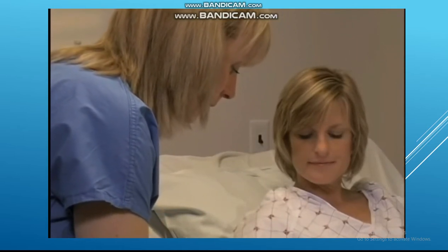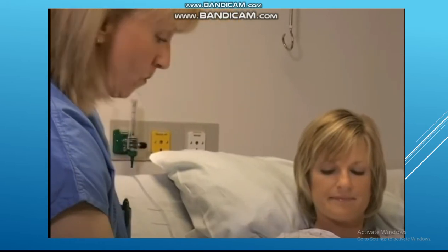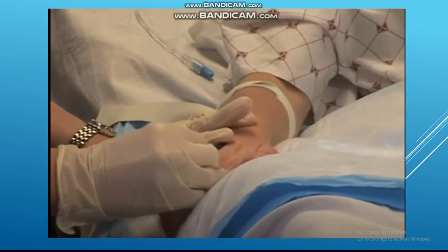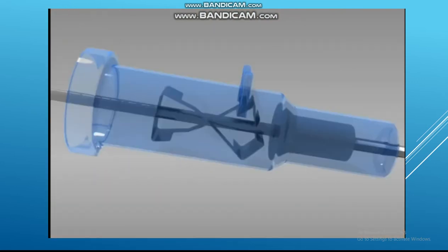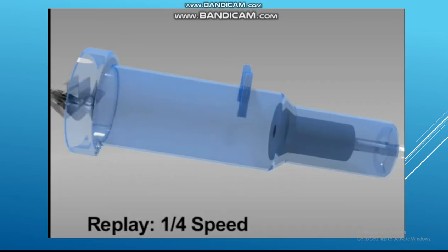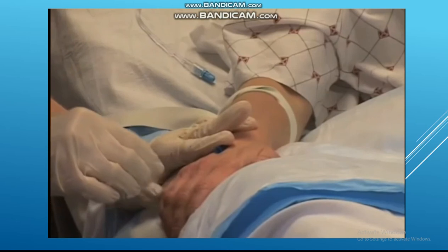Release the tourniquet and withdraw the needle completely. Once the safety mechanism is in lock, we prevent reinsertion of the needle. The reinsertion may damage the catheter and cause an artificial embolus. It also prevents injury to the staff as well as the patient.